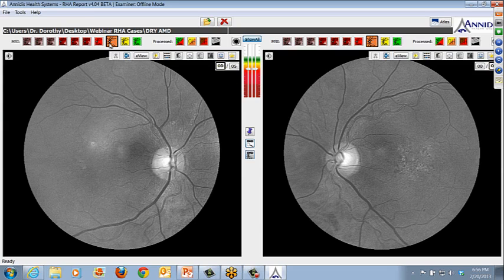But you're not going to be able to use that screening necessarily as a point of differentiation. You really need the full spectrum in a nicely dilated pupil with good technically reliable and obtained images, such as you have here.